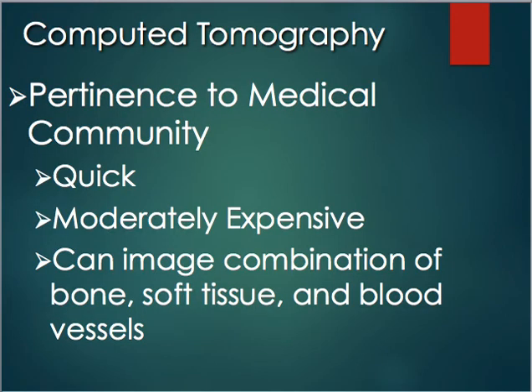The pertinence to the medical community for CT is huge. I mean, the invention of CT transformed our whole field of medicine. It gave us a new glimpse into the body where standard x-rays just couldn't. So CT is very quick, and it has the ability to image a combo of our bones, soft tissue, and blood vessels. And I said that before. I mean, x-ray is good at looking at the bone, ultrasound's good at looking at soft tissue, and angiography is good at looking at the blood vessels. But this finally combined everything together so that we were able to see that.